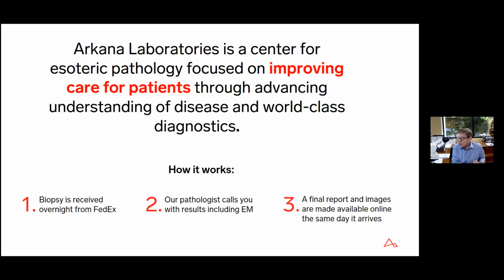So today's Tuesday. Today, we received roughly 100 biopsies that were performed on Monday. And by the end of today, we'll have a final diagnosis for each of those biopsies. And we'll call the clinician and have that discussion so that they can move forward with treatment for the patient with minimal delay, 24 hours at most.